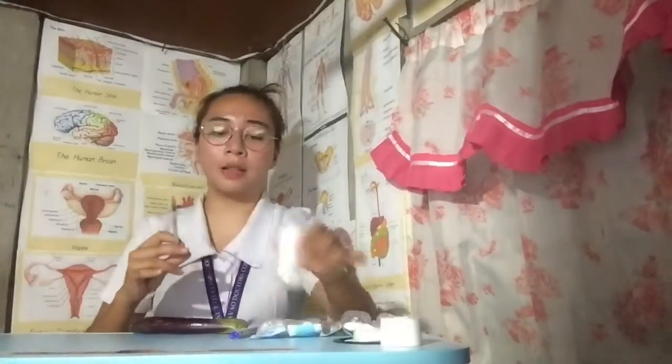Carefully insert the needle into the upright vial, through the center of the rubber cap, maintaining the sterility of the needle. Okay, now the needle is here.